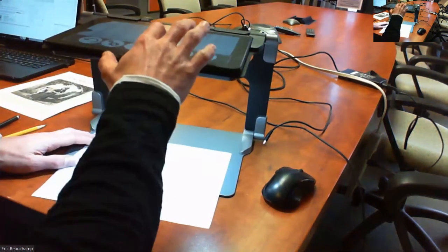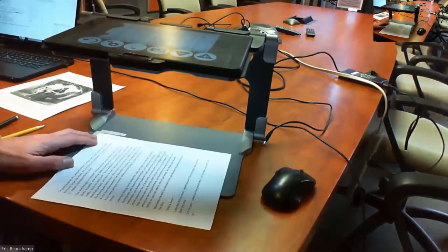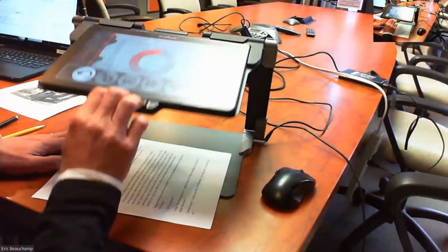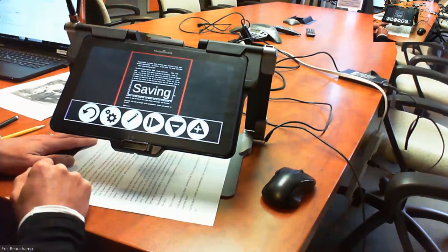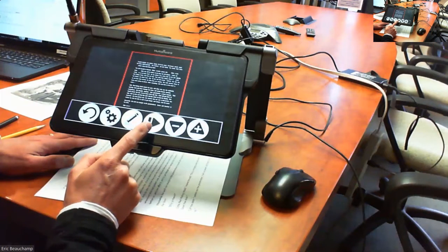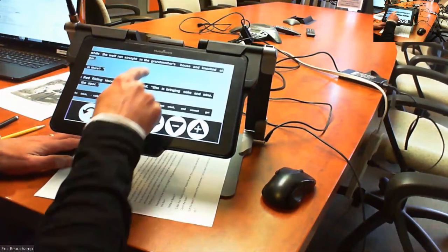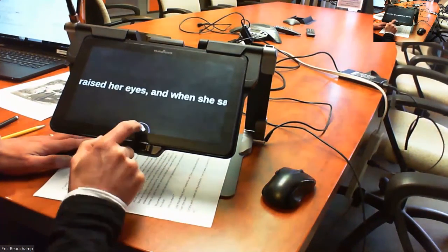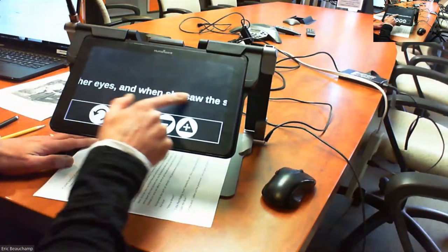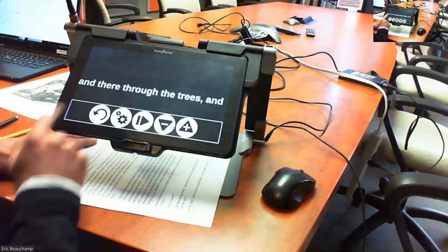So, I'll save this image right now so we'll have something to come back to without me capturing the image all the time here. So I'm going to save that. There we go. So if I don't press the play button, which is the fourth icon starting from the left of the button banner, and I zoom in, I can scroll through that text. It's going to be in page mode. If you want, you can start reading, and it's going to put it into line mode. Just pause it, and on the screen, you can go with your finger and do it manually. Just scroll through the text.